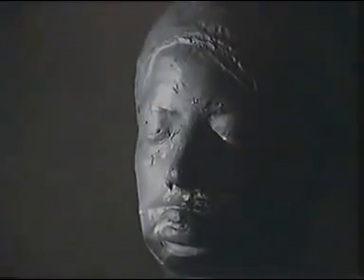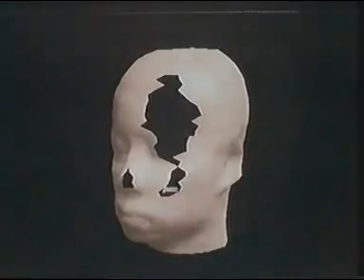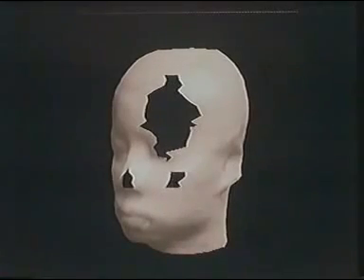From this demonstration head with a real skull inside, a model is produced by the computer which uses data taken from these special X-ray pictures. Real patients will be scanned by harmless beams of light. Even using a relatively large computer, this picture takes a long time to draw. The machine has to work out which pieces can be seen and which are hidden from view.